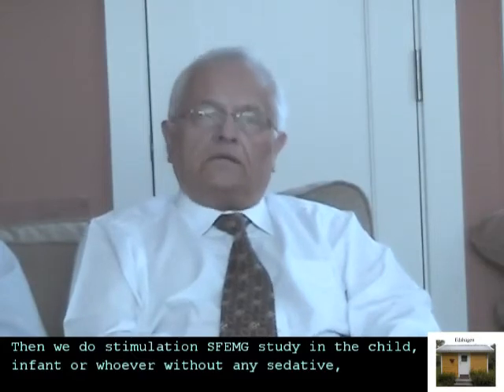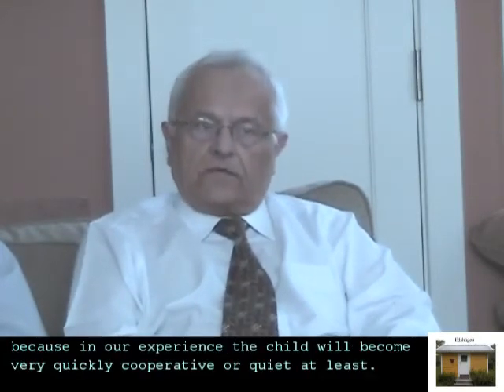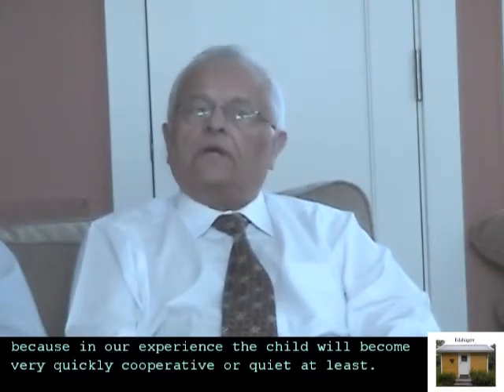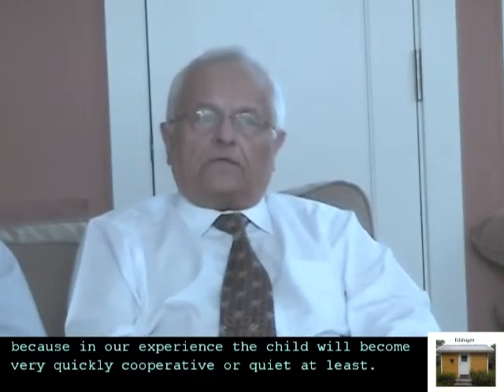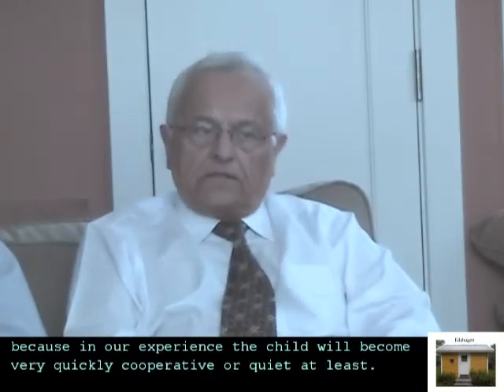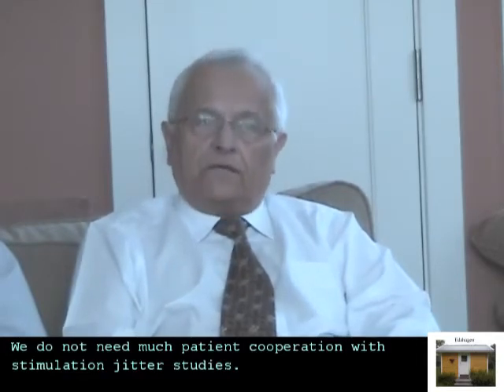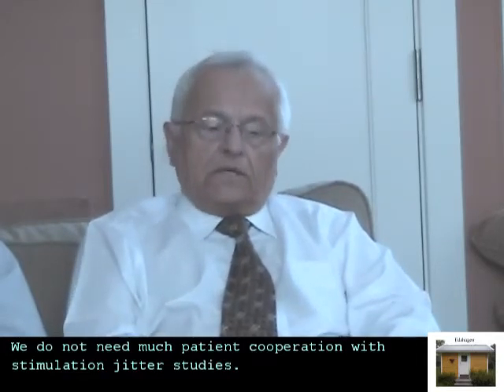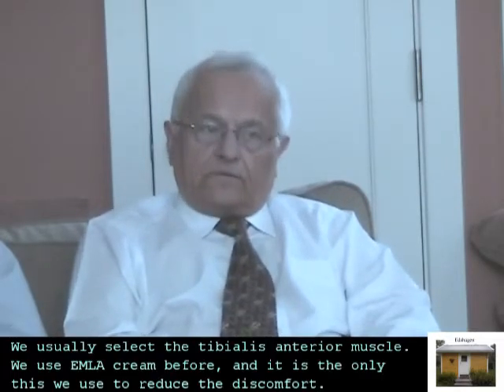without any sedatives, because in our experience, the child will become very quickly cooperative or quiet at least. We do not need much patient cooperation with stimulation jitter studies. And we usually select the tibialis anterior muscle.